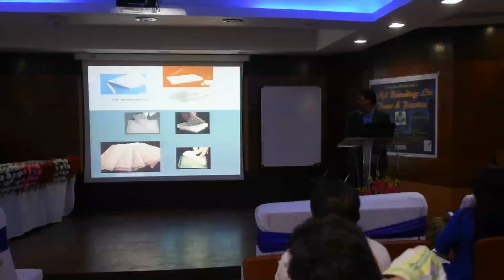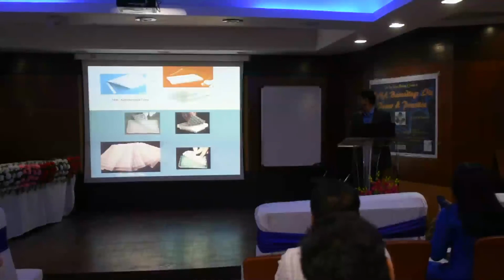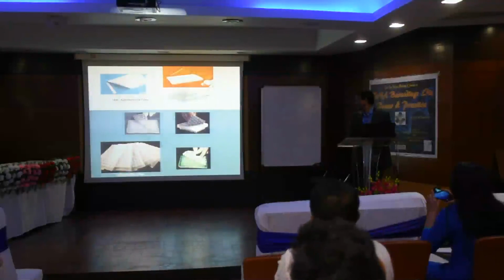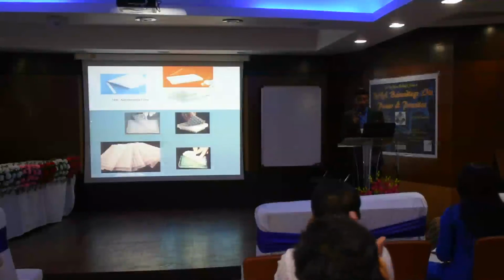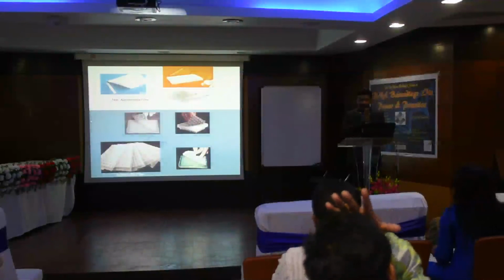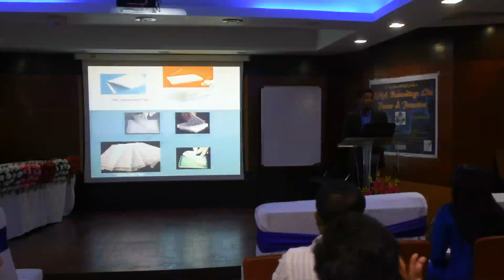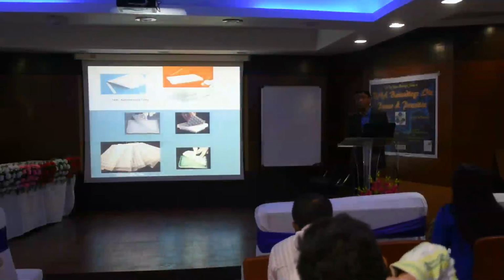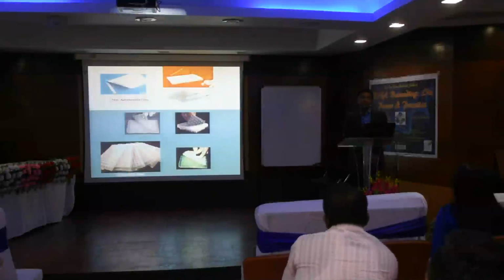Then you have smart things like non-autoclavable films, and autoclavable films. Then such types of mats you can use, with multiple uses. And these are the autoclavable films. Instead of use-and-throw film, one box of 100 sealers costs 3,700. In spite of that, this type of box costs almost 7,700 to 9,000 rupees.